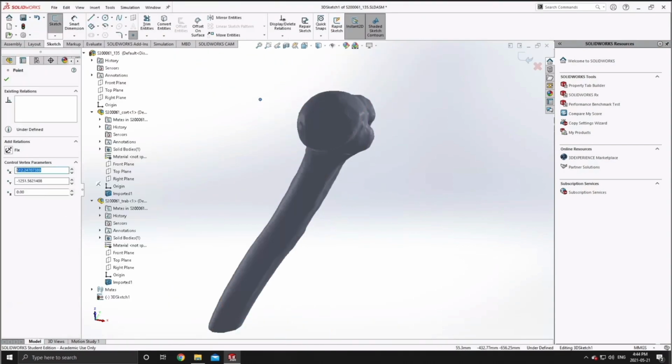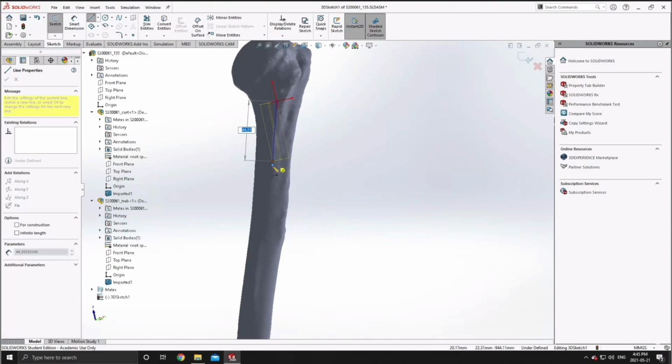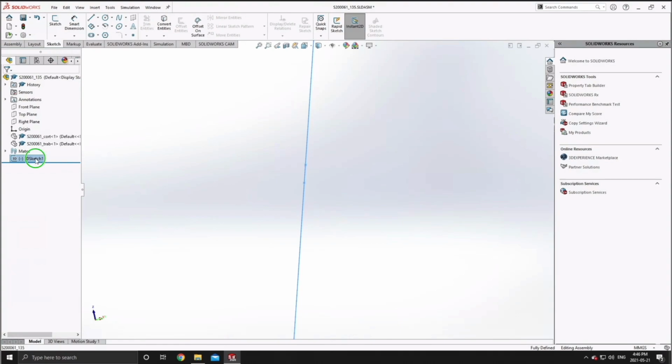Now, as we proceed here, we're just going to create 2 points, and using those values that you wrote down previously, you're just going to input these points, and they're going to self-locate at the centroids of the cross-sectional cuts that we made earlier. Now that you've isolated those 2 coordinates, just put a line between them, and you've got your central axis.